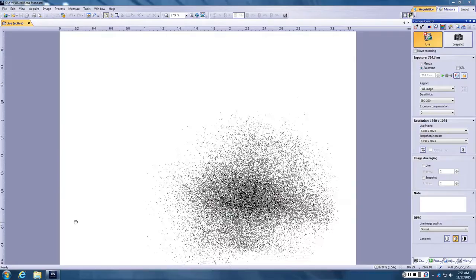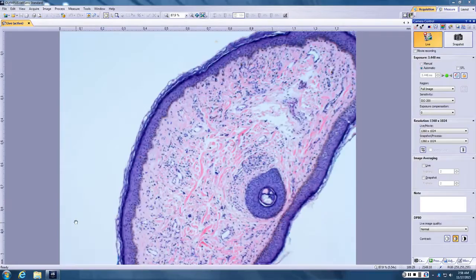Okay. So I see a few dilated spaces that look like lined with endothelium, that look like blood vessels. Yeah, so you've got some blood vessels and some inflammatory infiltrate there with lymphocytes and a few larger cells. And the few larger cells are kind of stellate.